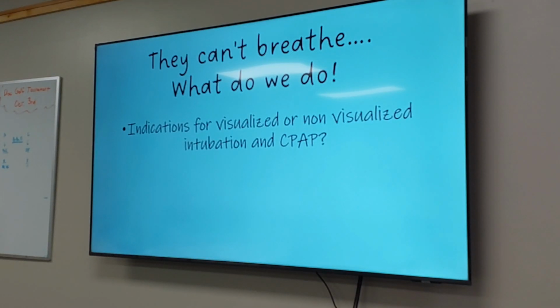Non-visualized airway is a little more strict at a basic level because you guys can't take somebody's airway away. Like you can't give them meds to stop their breathing. So you can really only use it for cardiac arrest or respiratory arrest. And indications for CPAP would be respiratory distress, congestive heart failure, bronchoconstriction. They said toxic inhalation, which I thought was interesting, and drowning, because it helps push that fluid out.